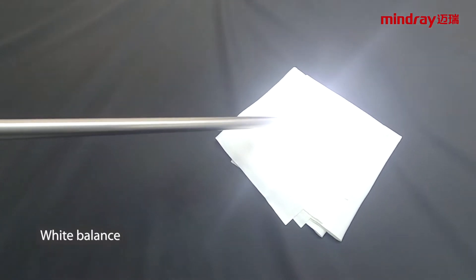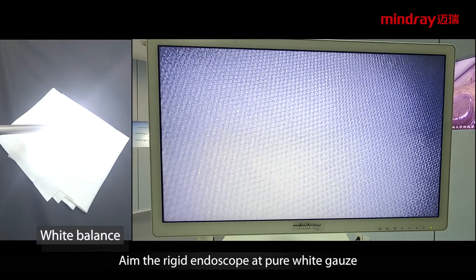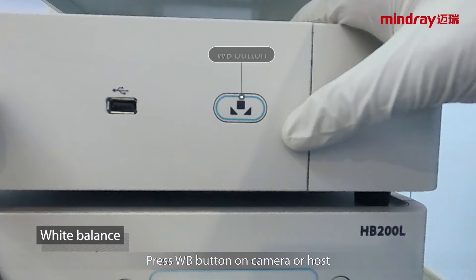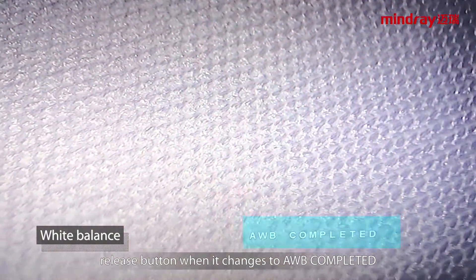White balance: aim the rigid endoscope at pure white gauze and ensure the field of vision is white. Press the WB button on the camera or host. The display shows AWB busy. Release the button when it changes to AWB completed.